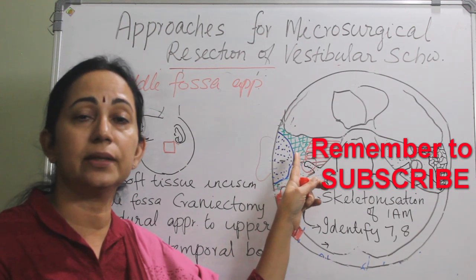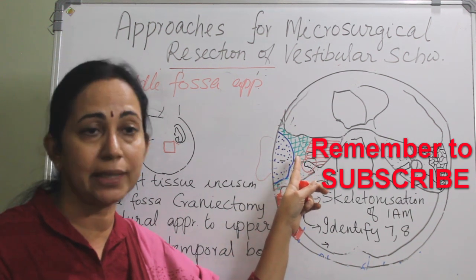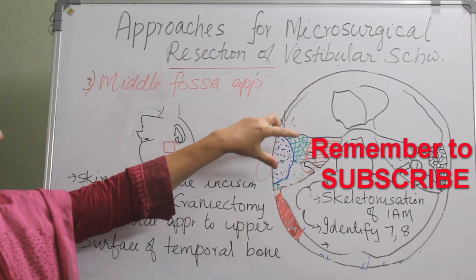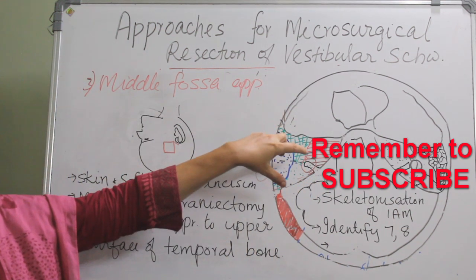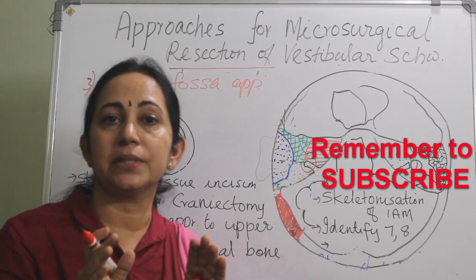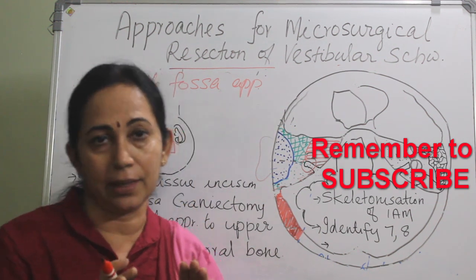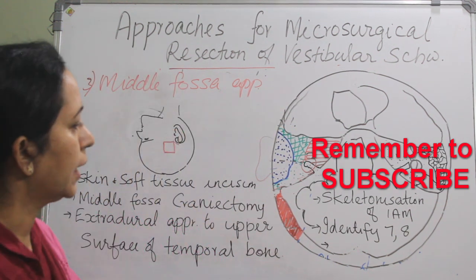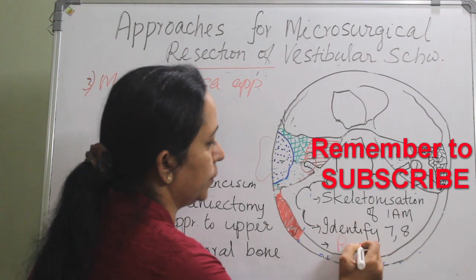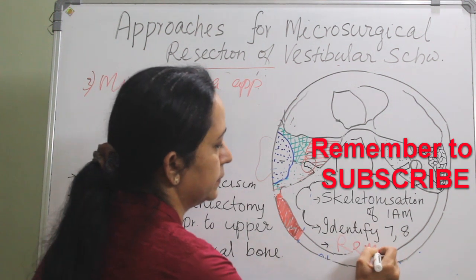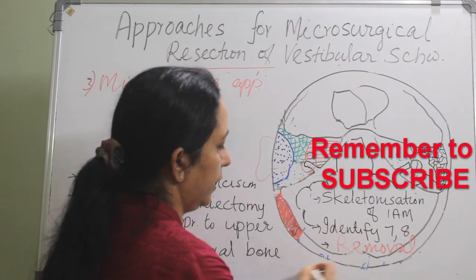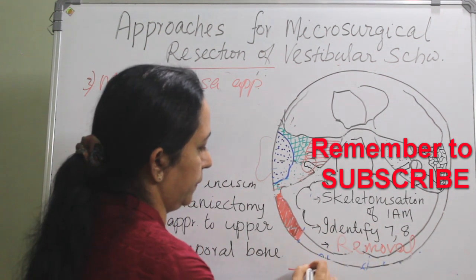We can then identify the 7th and 8th cranial nerves. The tumour is identified and dissected out from the 7th and 8th cranial nerves, followed by removal of the tumour and then closure.